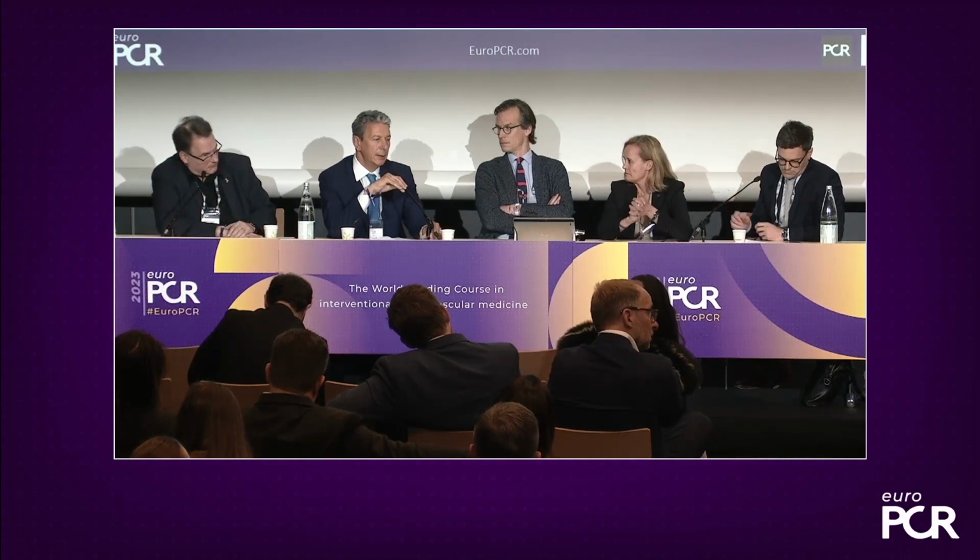The quality of intracardiac echocardiography from the right side of the heart for the LAA is not very good. At the beginning of the story of the use of ICE for LAA closure procedures, we advanced the probe in different positions. The best solution was the coronary sinus, and the quality of the imaging is excellent. The main problem is that engaging the coronary sinus is complex and potentially dangerous, and the only solution is to advance the probe through the fossa ovalis in the left atrium and to advance the probe at the ostium of the left superior pulmonary vein. You have a perfect visualization of the LAA, and you acquire the volume, and using multiplanar reconstruction, you can do exactly what you do with the TOE, or evaluate the landing zone exactly as you do with the CT scan.